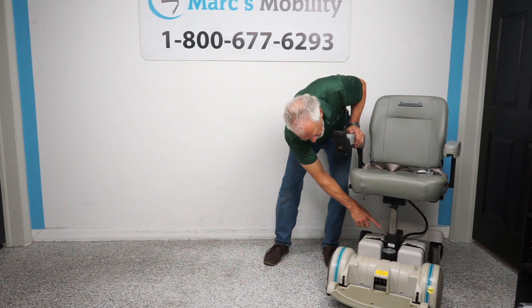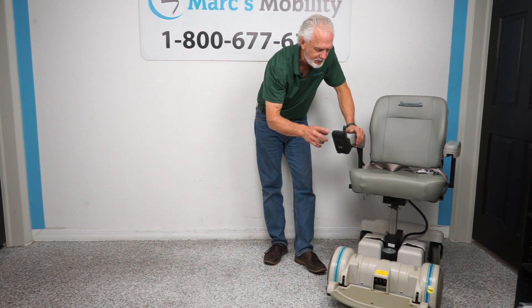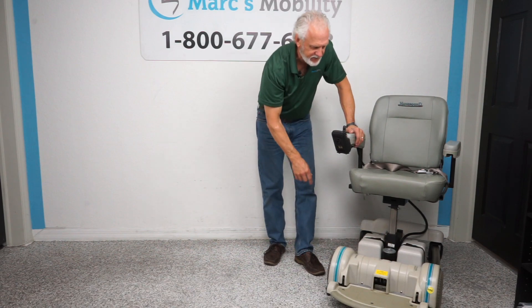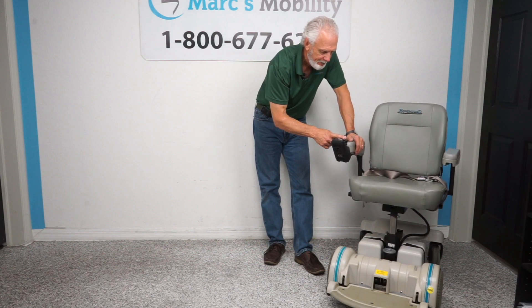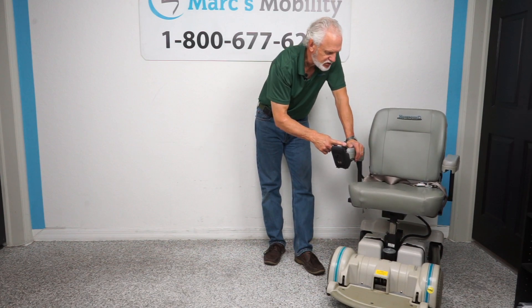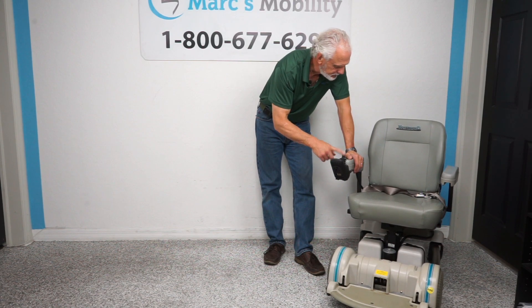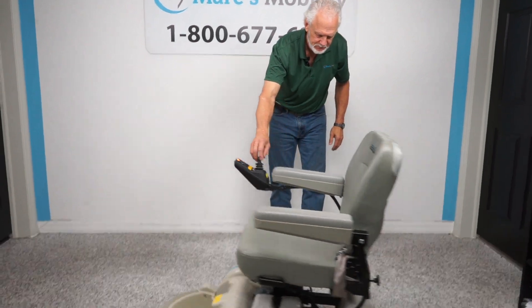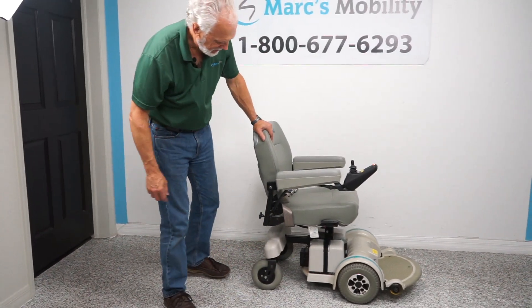This chair will not drive with the seat elevated. There's a sensor here — this button has to be pushed down before it can drive again. The chair has an inhibitor to stop it from driving while the seat is raised. Bring the seat back down and the chair will start driving again.